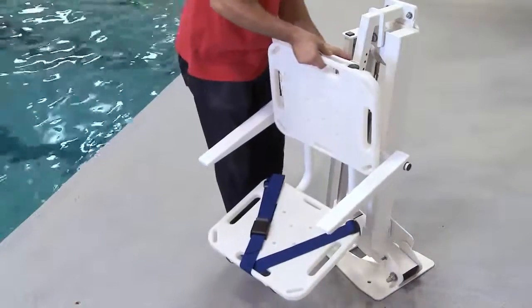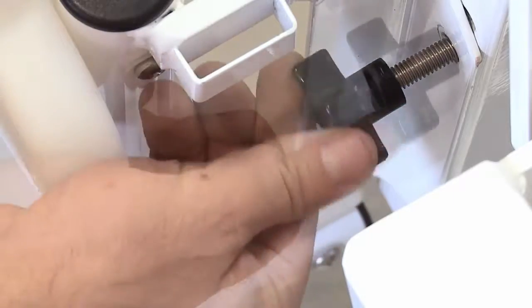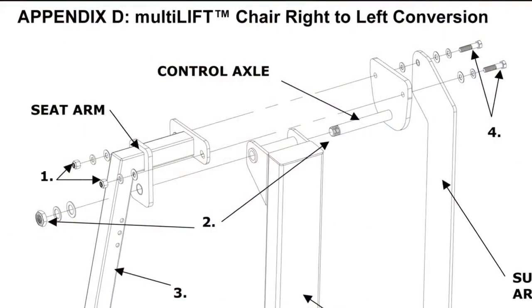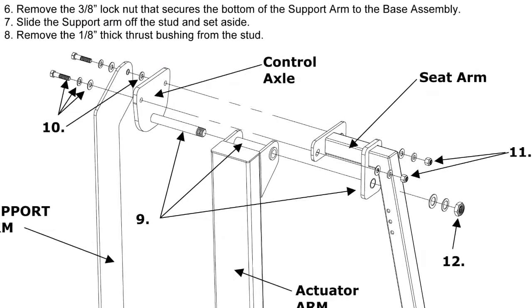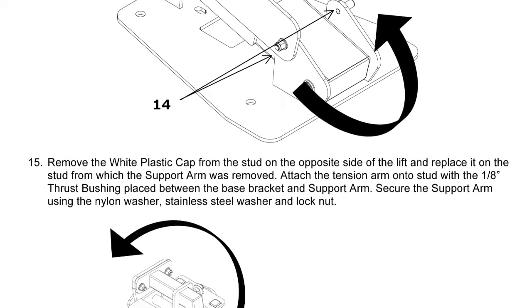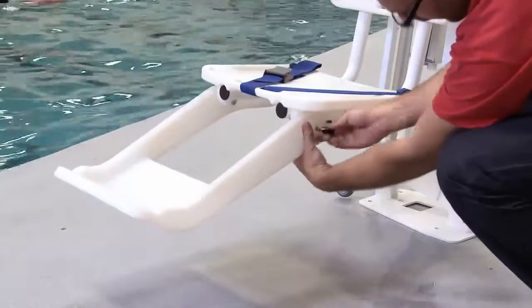The multi-lift comes standard with a right seat mounting configuration. The seat assembly is secured to the mast with the bolts provided. Based on the lift orientation to the pool, you may need to change the seat orientation to a left seat mounting configuration. Consult the installation instructions for details. The footrest is attached using the hardware provided.